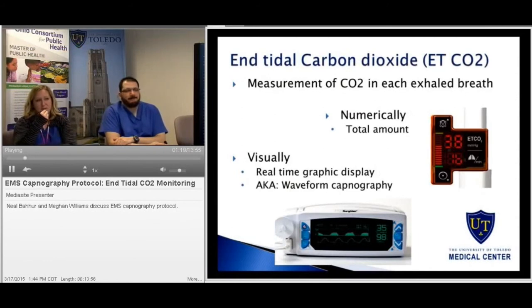What is end-tidal CO2 monitoring? So end-tidal CO2 is the measurement of carbon dioxide in each exhaled breath. You can see this a number of different ways, either numerically, which will give you the total amount of the CO2 that's being exhaled, or you can see it visually, which is a real-time graphic display, also known as the waveform capnography, which is what we typically use in the hospital and pre-hospital setting. This can be seen at the bottom of the screen. Those waveforms that are filled in, those are the real-time displays of end-tidal CO2.